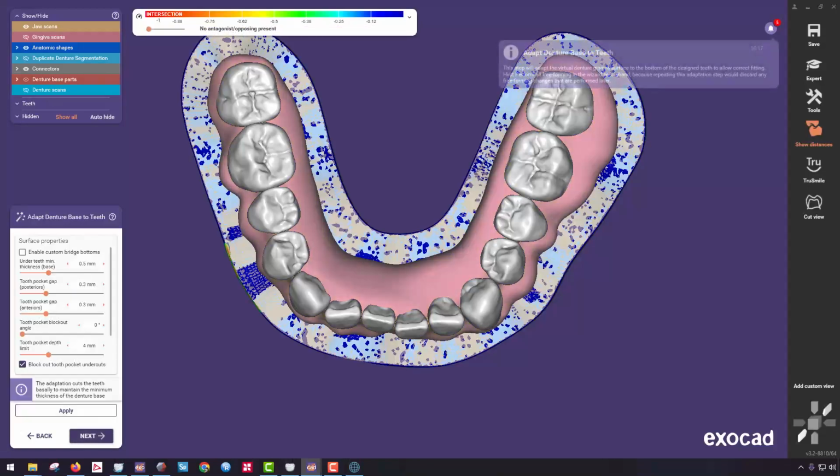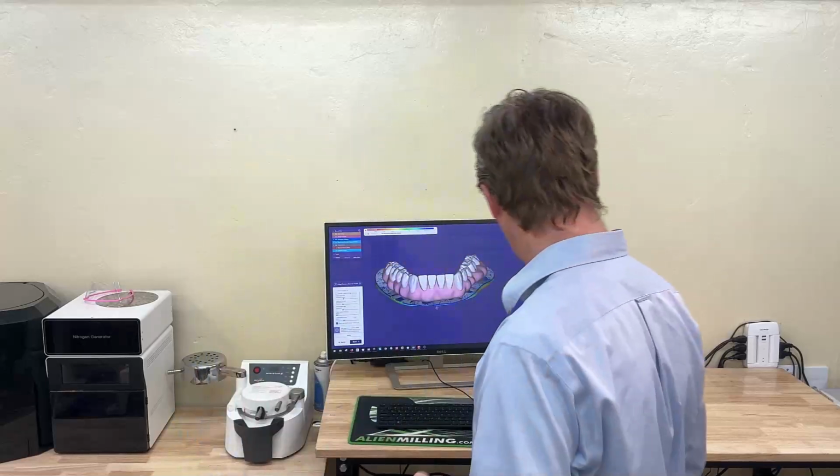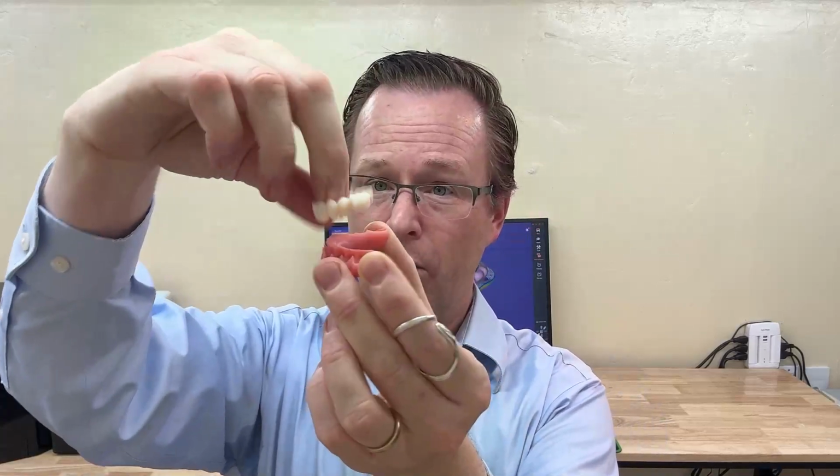And now it's going to go through the calculation. What settings do I set on here to verify that I've got the correct gap space between them? A lot of this is just based upon experience, everybody. So if I'm 3D printing an arch, typically I want 0.3 up to 0.5 millimeter gap distance between where the teeth and the base are. Because a milling machine needs a burr to go into all these little pockets, and sometimes it can get lost along the way. But I found from experience, usually for most printers, 0.3 millimeters is pretty ideal. In a milling machine, 0.3 to 0.5 is also ideal, depending upon your milling machine and your 3D printer.